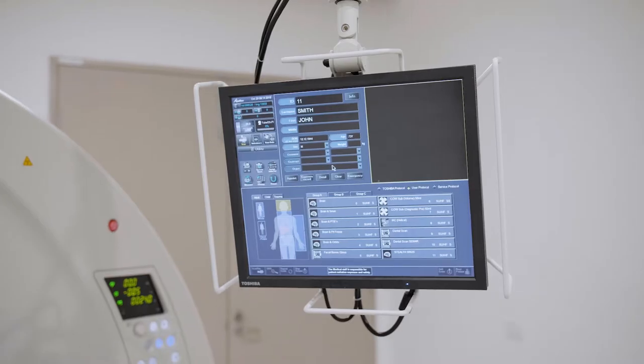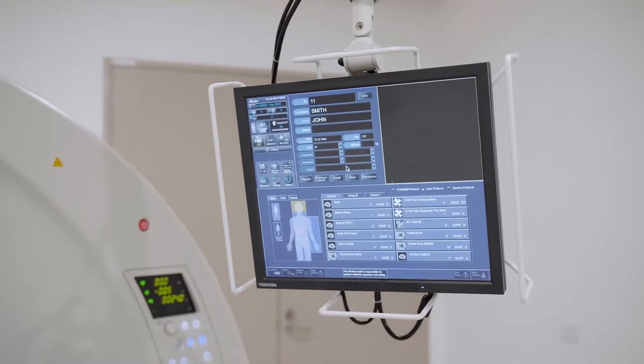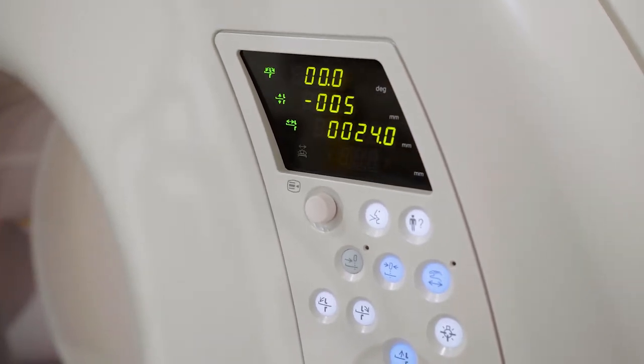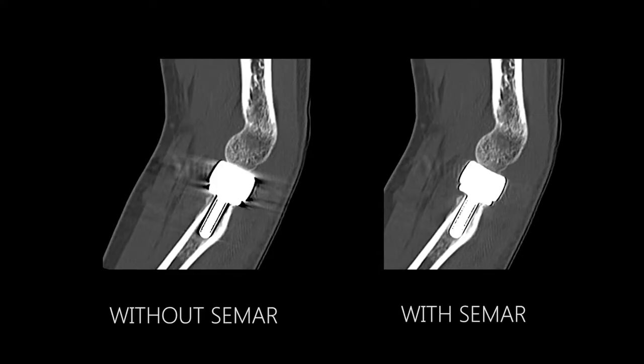By being able to use the 16 centimeter coverage, we've been able to scan the areas of interest within one volume. By using SEMAR — that's the metal artifact reduction technology on the Aquilion ONE — we've actually been able to demonstrate loosening of prostheses.